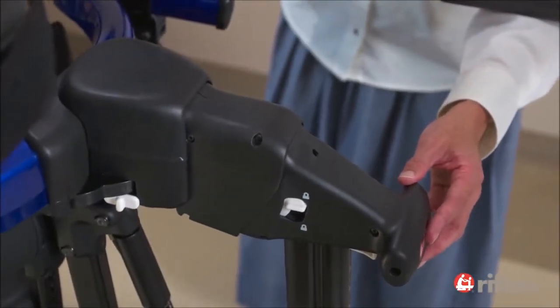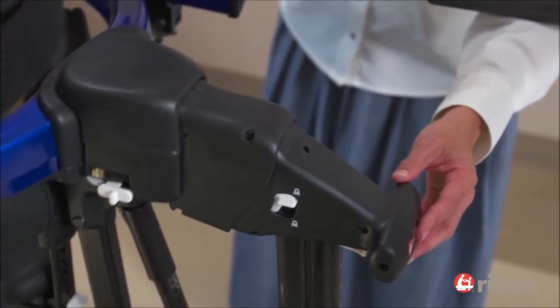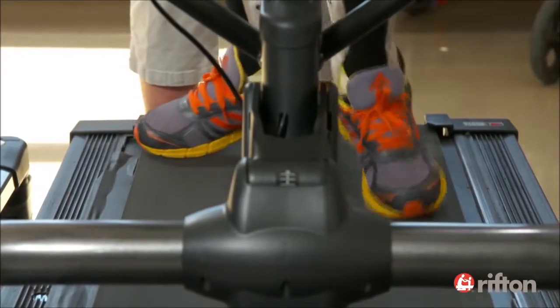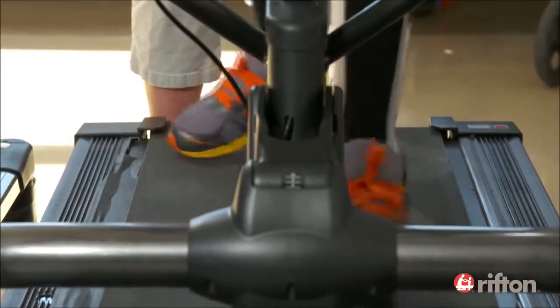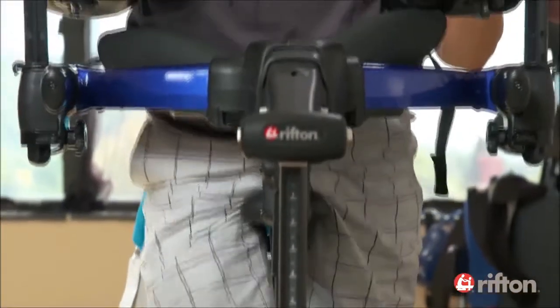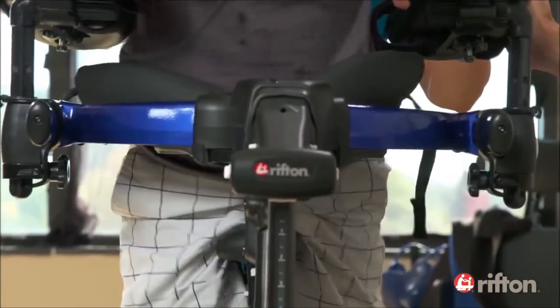With practice, Scott will improve his ability to walk on a treadmill. This option enables him to do more walking at home, where space and opportunity for overground walking are very limited. On the treadmill, Scott can continue to increase his walking strength and endurance.